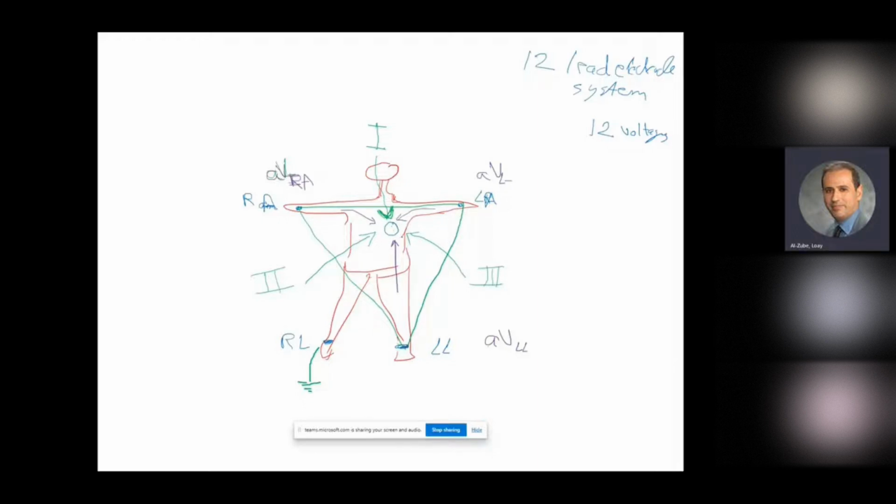I have 6. So we said this is the human body. We have 1 electrode, 2 electrodes, 3 electrodes, 4 electrodes. If anyone goes to the hospital, they will be placing those first. Now, the 4th electrode, which is the right leg, that's the earth, and we're not going to use it. If we draw a triangle from the electrodes that we build, we have the Einthoven Triangle.